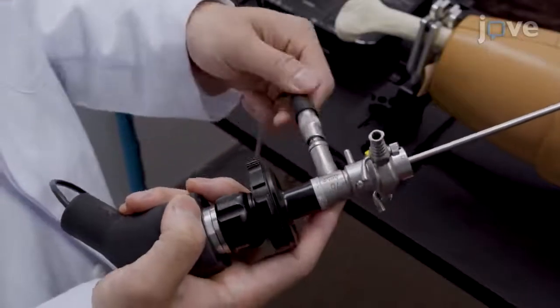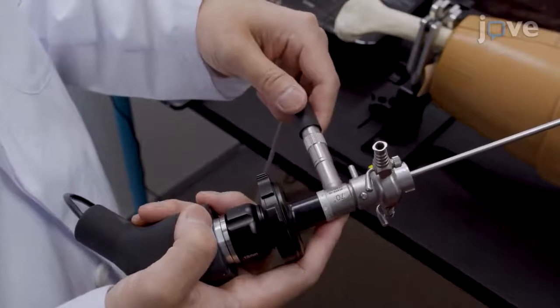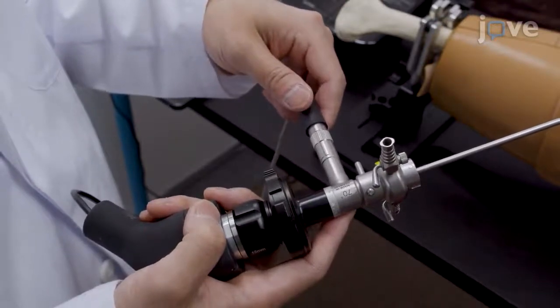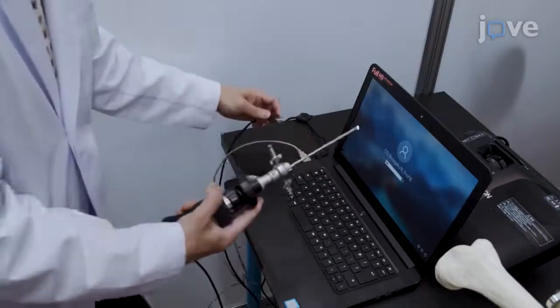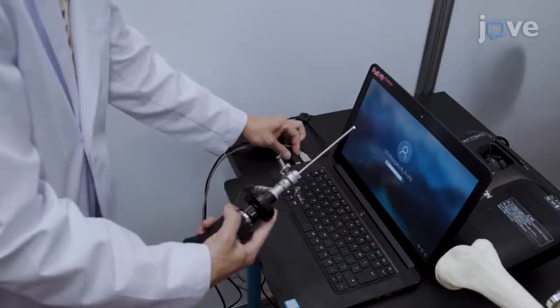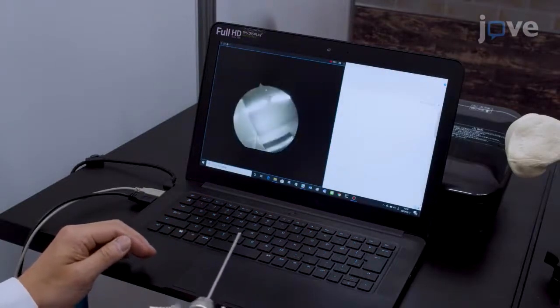To prepare the arthroscope, connect a portable arthroscopy camera light source to a 4 mm 70-degree autoclavable direct-view arthroscope, and connect USB cables from the arthroscopy camera and light source to a computer. Then open the advanced screen recording software for the arthroscopy view.